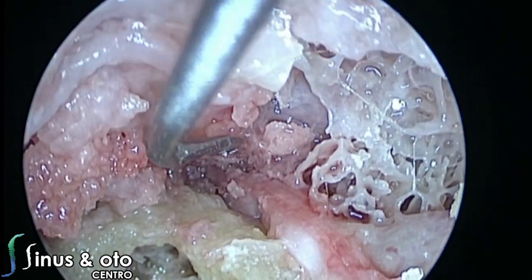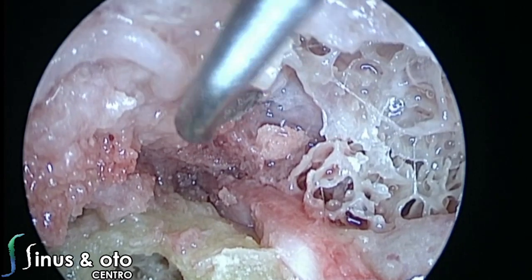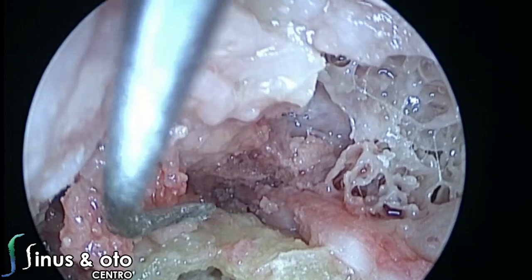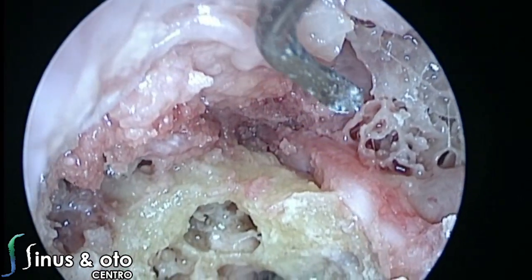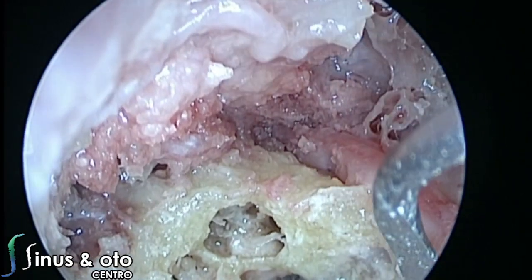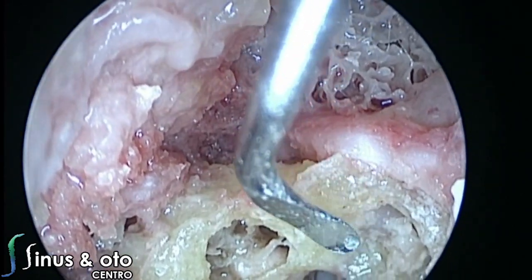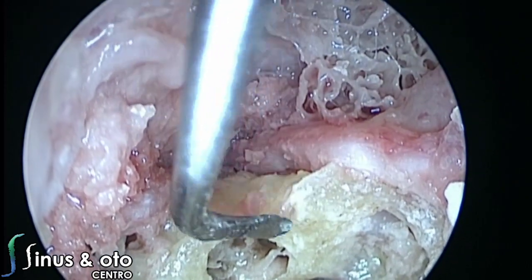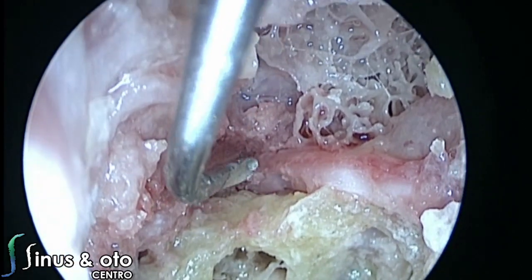So we have here the tegmen, here the region of the supratubal recess, here the region of the anterior tympanic space, the cog between, and then we have all these anatomical structures, which are very important and very nice to understand. The lateral semicircular canal is going to be above the facial nerve. This is the vestibule, endolymphatic sac over there, and of course you can have different configurations, different anatomical structures.